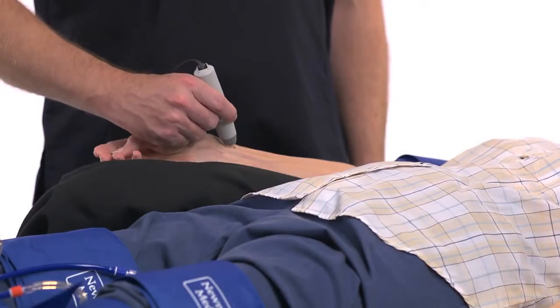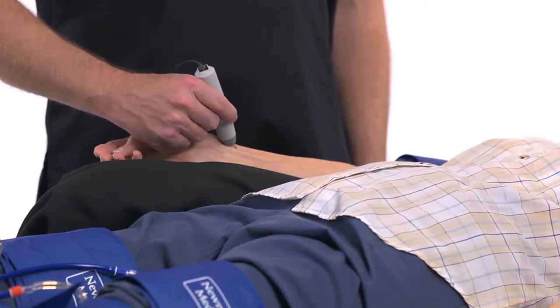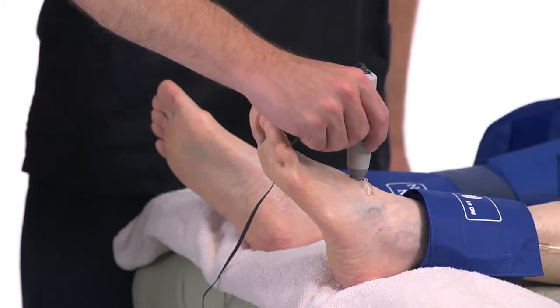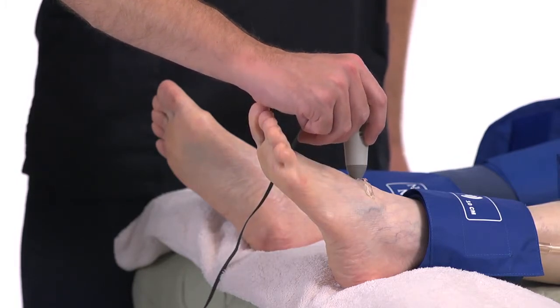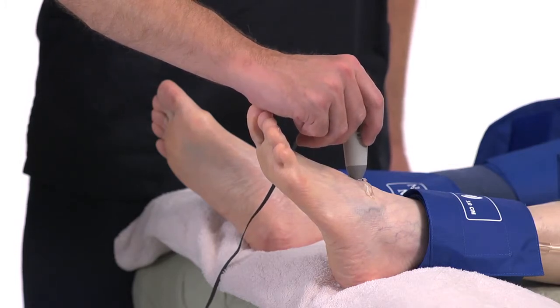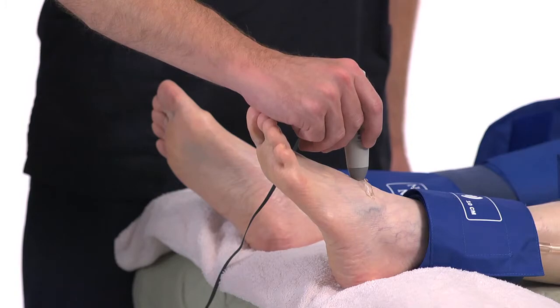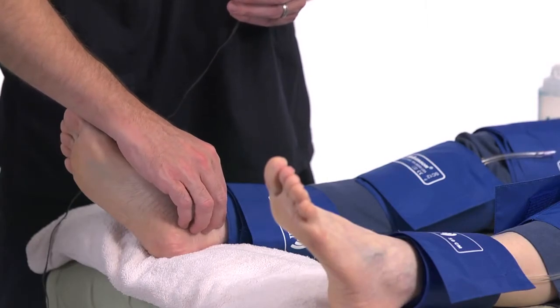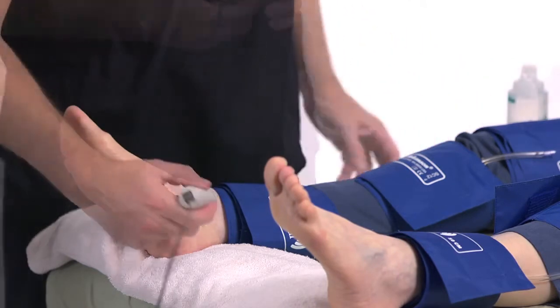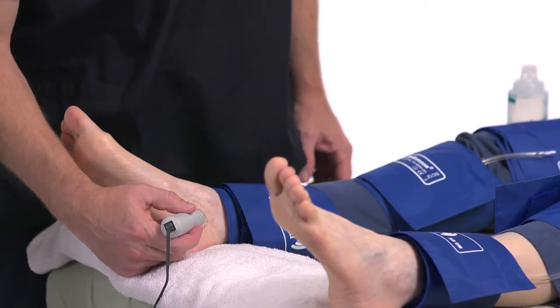When taking the arm pressure, the radial artery is usually preferred because it is easier to find; however, the brachial artery may also be used. Lightly palpate the artery and place the Doppler probe where a pulse is felt. For the dorsalis pedis or DP, find the artery by putting your finger between the bones of the great and next toe and slide towards the ankle until you feel the pulse. Use plenty of gel and move the probe back and forth to find the loudest arterial sounds. Be sure not to press too hard, as the artery lies over metatarsal bones and can easily be occluded. For the posterior tibial or PT, find the artery on the inside of the ankle, usually about a half an inch below and behind the ankle bone, about halfway between the ankle bone and the end of the Achilles tendon. Try to palpate the artery first.